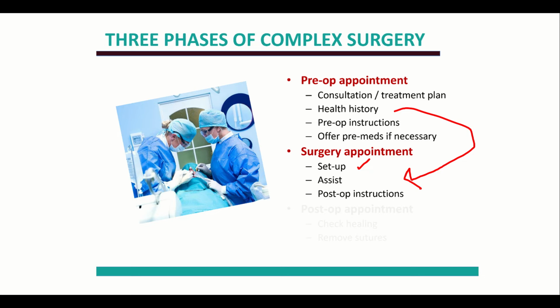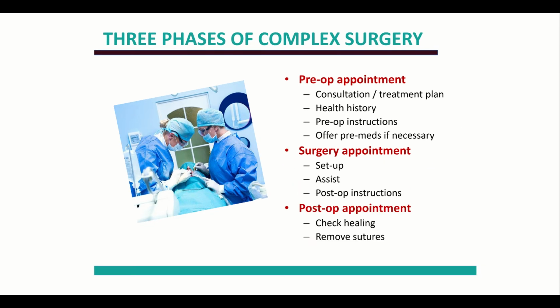So you're going to set up the operatory, assist the doctor when needed. Most of the time, most doctors want an assistant while they're working to help them. So you should be in there if it's your job. And then providing post-op instructions is really critical. We're going to talk about that here in a second. And you're going to provide those post-op instructions.